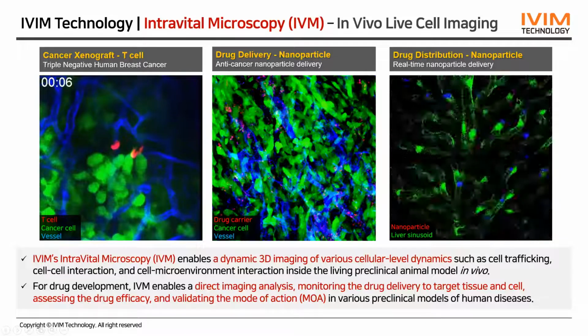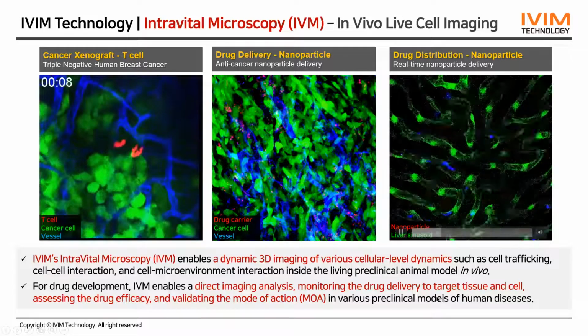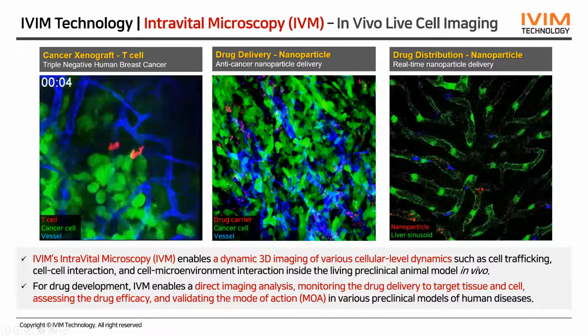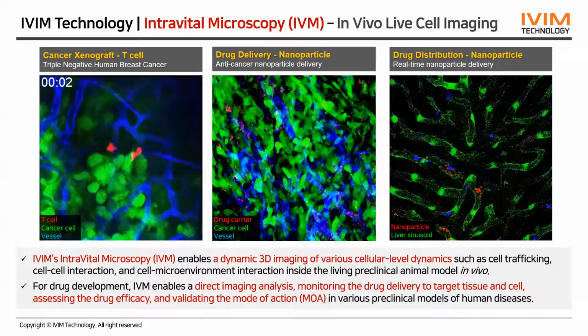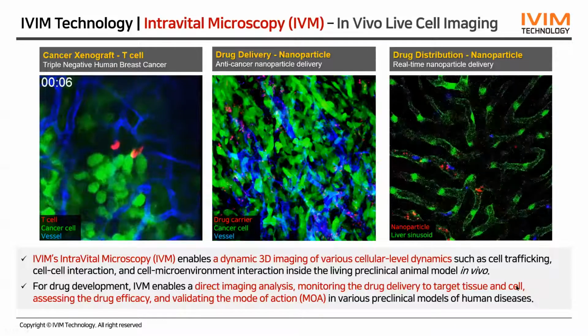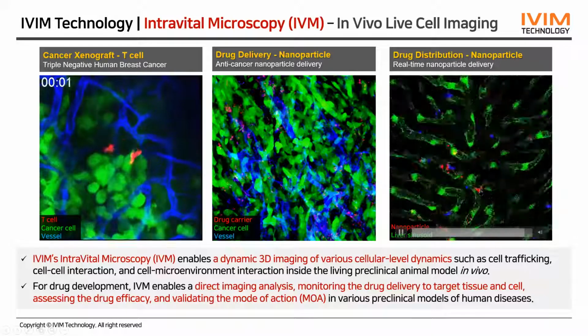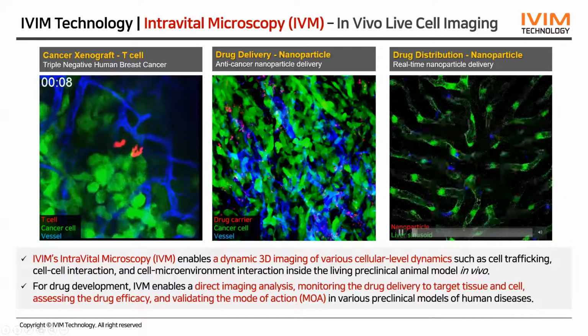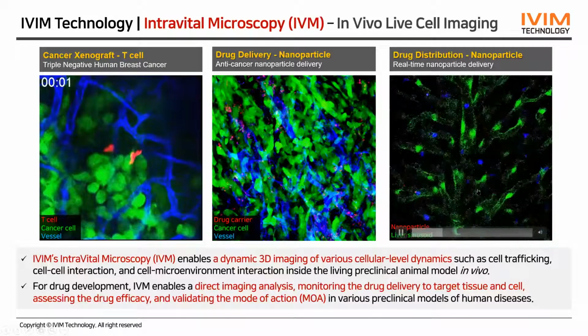On the right side is a real-time video showing the distribution of intravenously injected nanoparticles in the liver sinusoid.